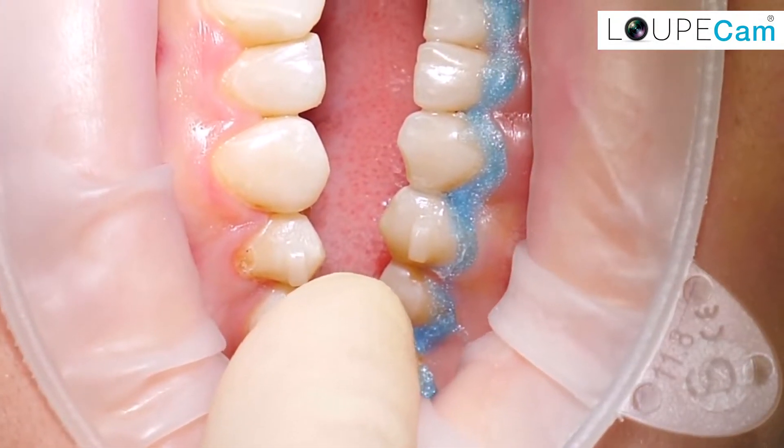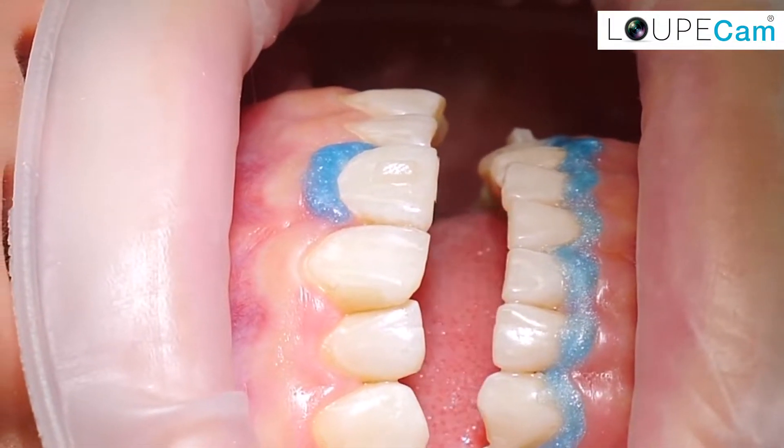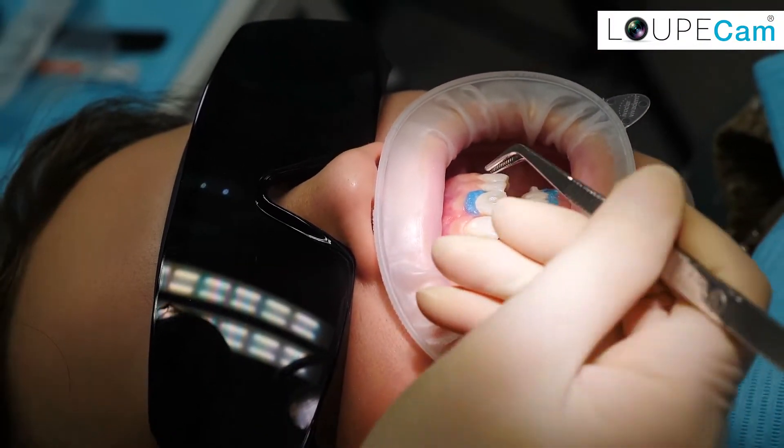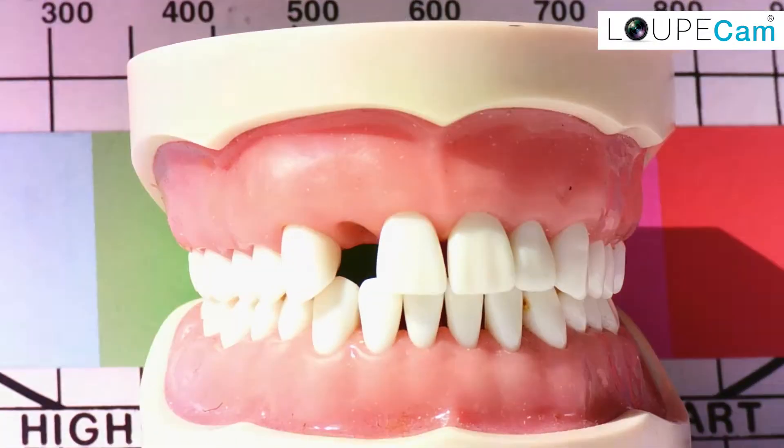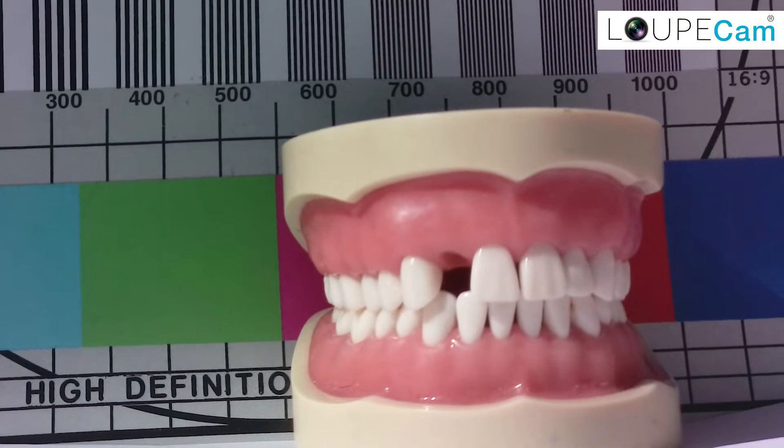This finally makes it so much easier to use during the preview, but also can save you a lot of time in post-processing, and your videos will look amazing. Our gimbal image stabilization is a game-changer. Just look at this shot without image stabilization, and now with image stabilization.